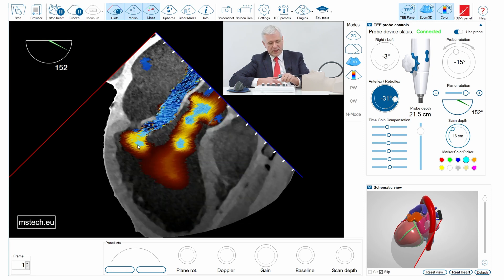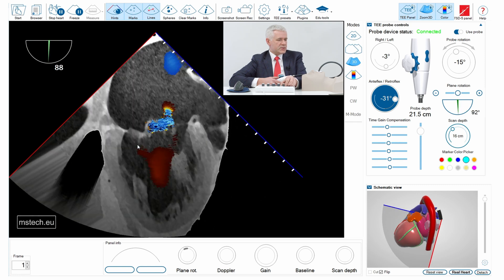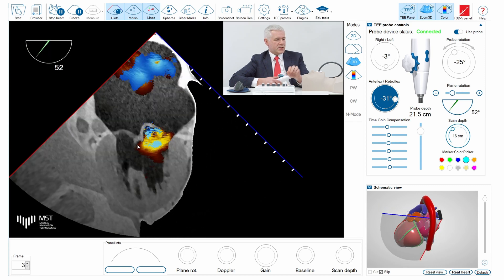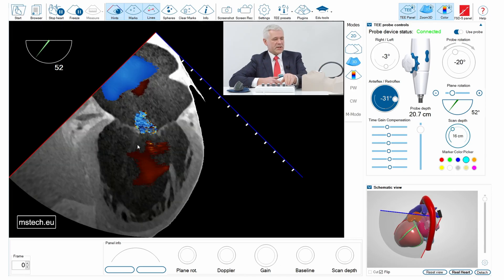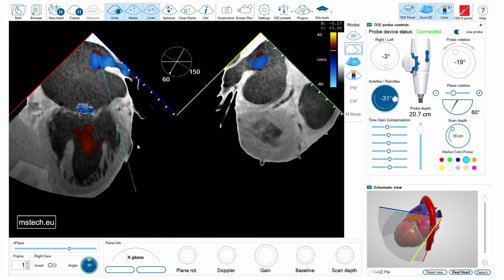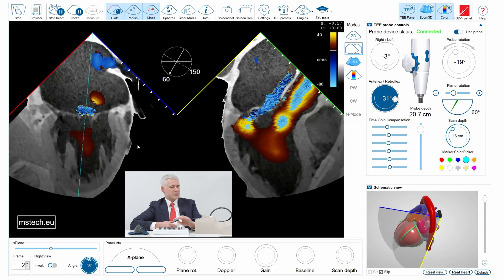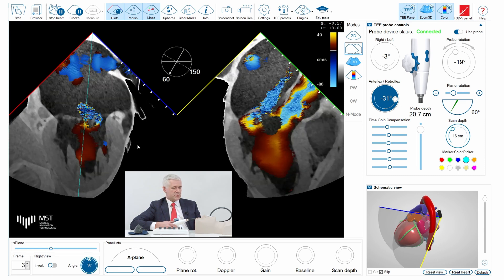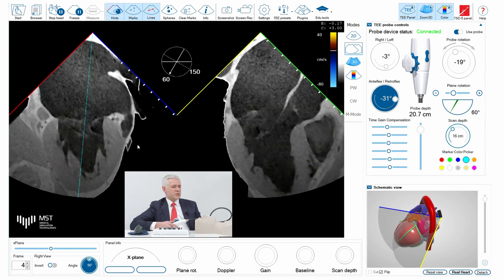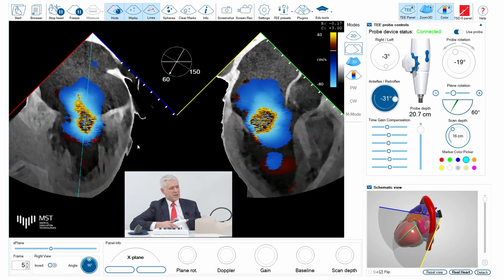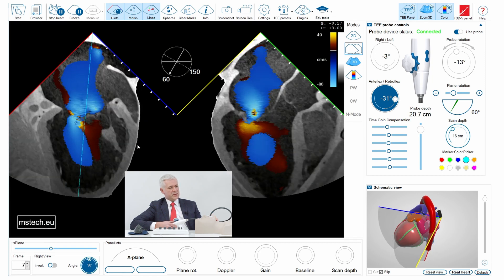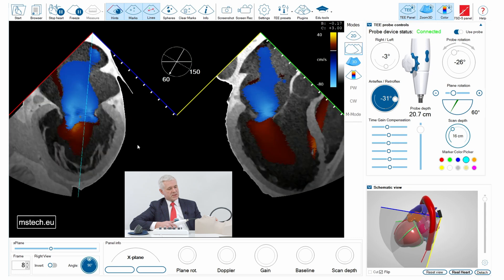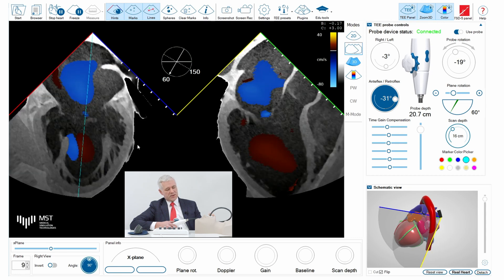I can visualize it better using the intercommissural view, with the valve centered to obtain a nice long axis view in X-plane mode. You can observe the eccentricity of the jet and the fact that the jet is limited only to the P2 prolapse. Scanning with slight anterior and posterior rotation reveals no other jets, confirming this is an isolated P2 prolapse.